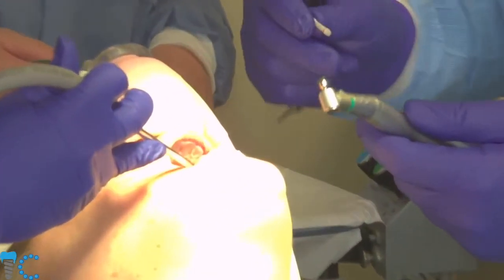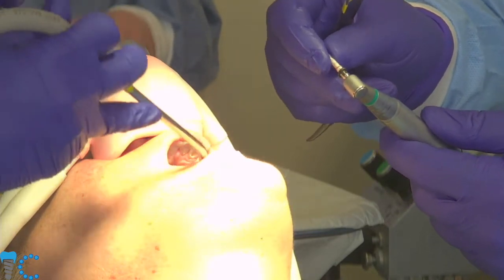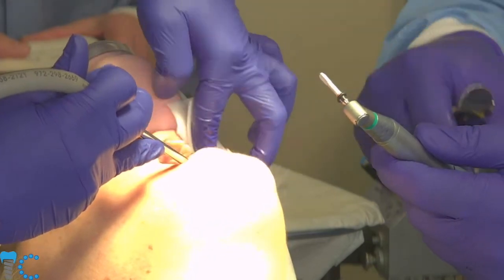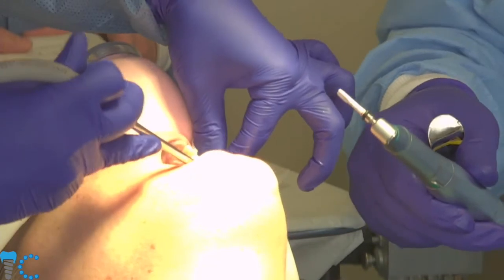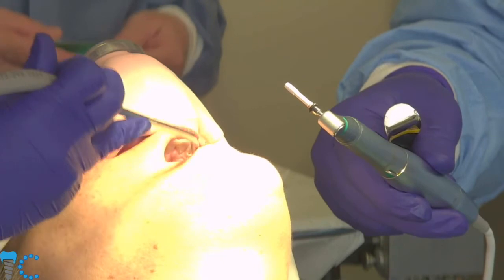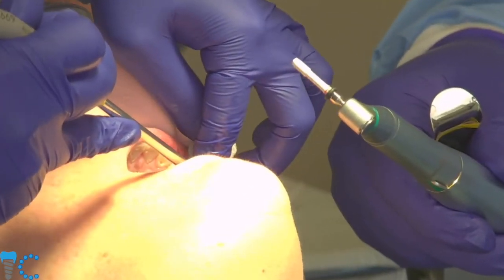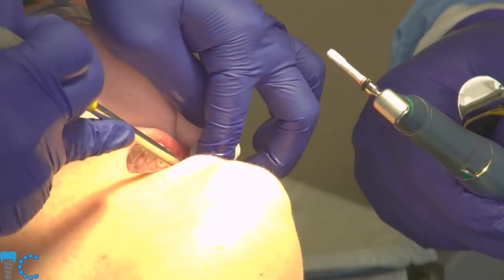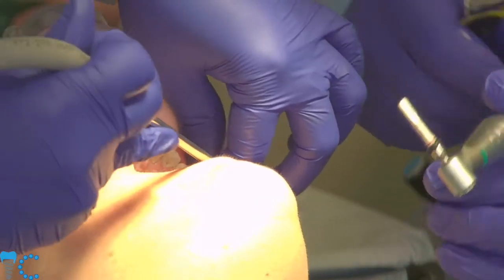And then the taps are color coded. There's a red ring on this one for a 4 millimeter tap. There's a green ring for the 5 millimeter tap. There's a yellow ring for the 3.6. So this is the 4 millimeter tap, and the first thing I'm going to do is run it outside the mouth. The purpose of that is to make sure that I remember to scale it down to 20 RPM. The last thing I want to do is put this in the implant osteotomy running at 800 RPM. That would be a disaster because we would strip out the osteotomy.